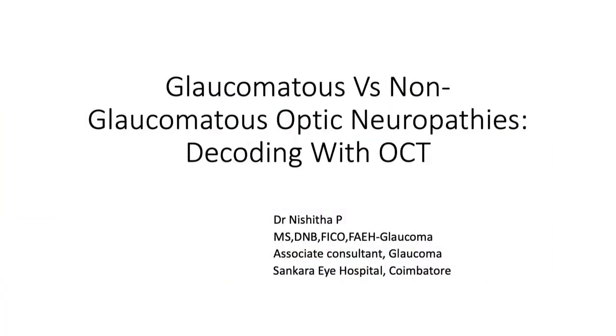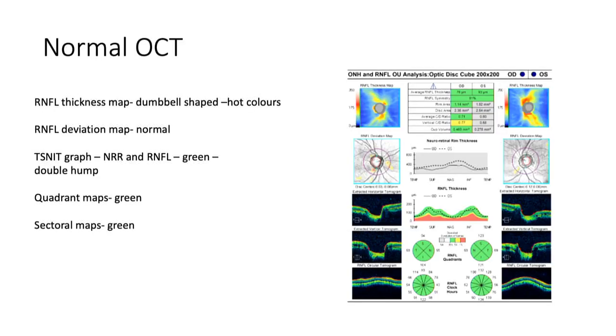Over to you. Thank you, Dr. Fahim. Good afternoon, everyone. I'll be dealing with glaucomatous versus non-glaucomatous optic neuropathies, and how to decode them in an OCT. Dr. Faisal has already given an elaborate talk on glaucoma as well as non-glaucomatous optic neuropathies, so I'll summarize. This is a normal OCT.